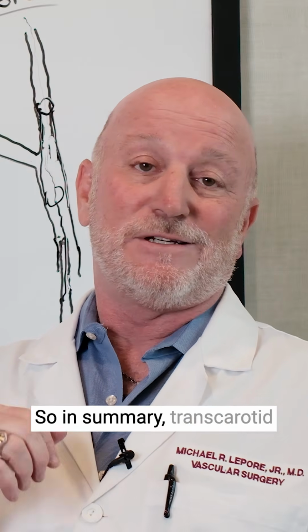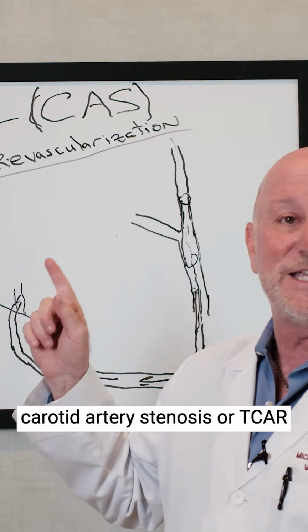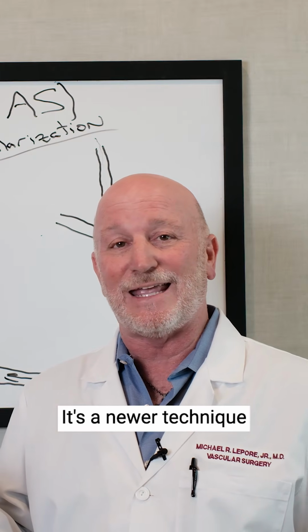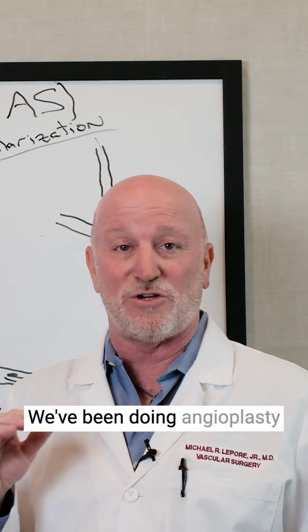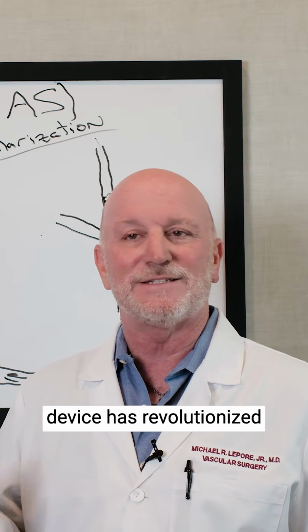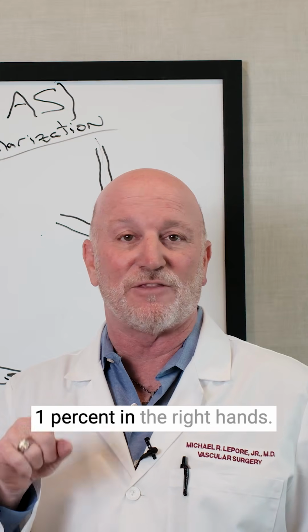So in summary, transcarotid artery revascularization for carotid artery stenosis, or TCAR, is used to treat blocked carotids. It's a newer technique in terms of the device. We've been doing angioplasty for many years, but this device has revolutionized and lowered the stroke rate in this procedure to less than 1% in the right hands.